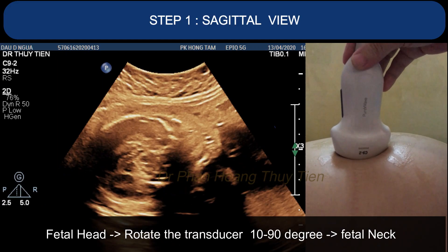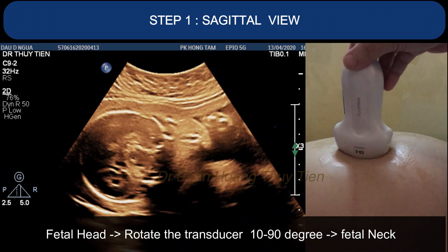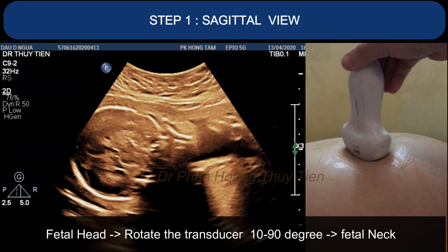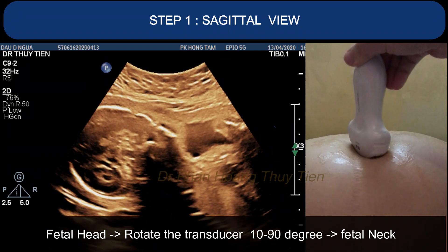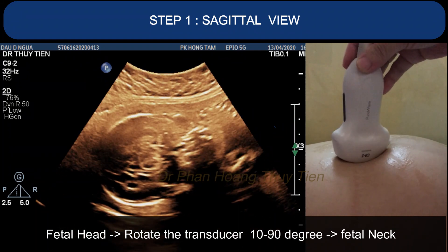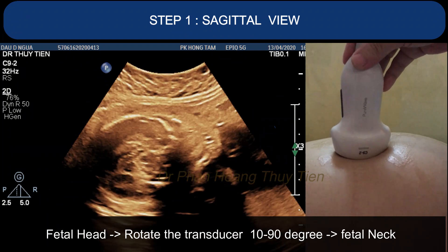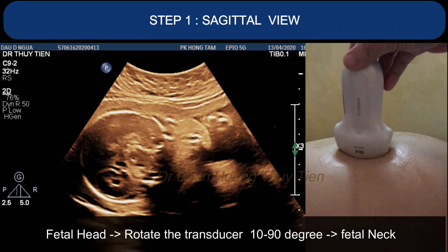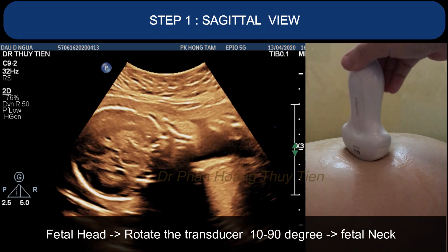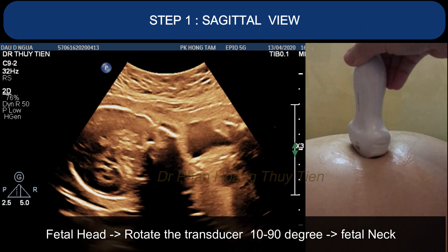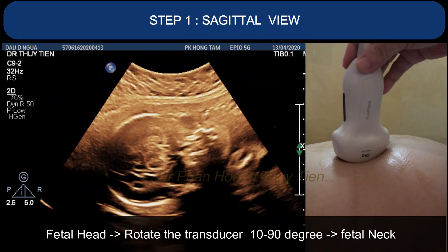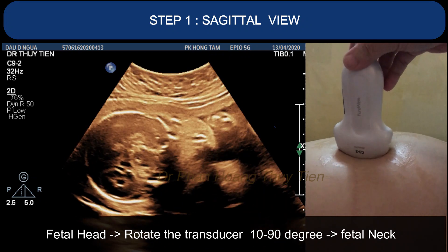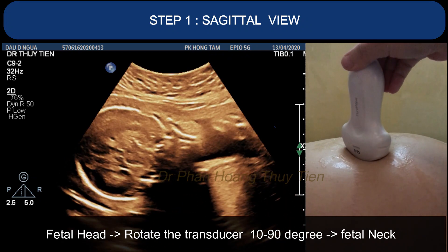Step 1: Sagittal view. First, you identify the fetal head. Then you rotate the transducer 10 to 90 degrees to get the fetal neck position.